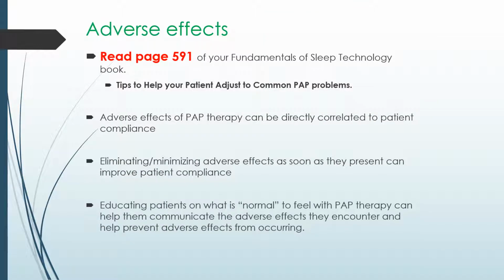If a patient has any adverse effects of PAP therapy, it is directly related to patient compliance. If a patient doesn't feel comfortable with their PAP device, they're not going to wear it. So one of our big roles is to eliminate and minimize any adverse effects or complications the patient has as soon as the patient notices them, as this is going to help the patient want to wear their CPAP every night. Always educate your patient on what is normal to feel with PAP therapy, and then help them communicate their adverse effects as they encounter them to you.